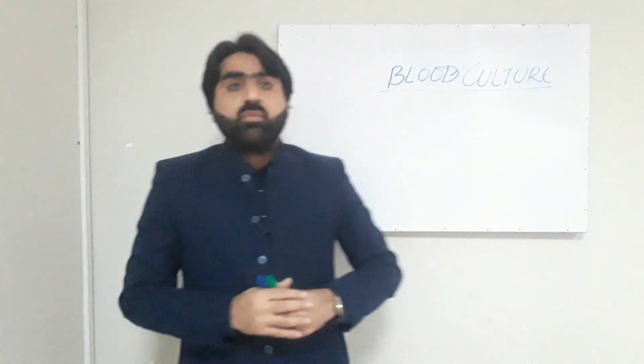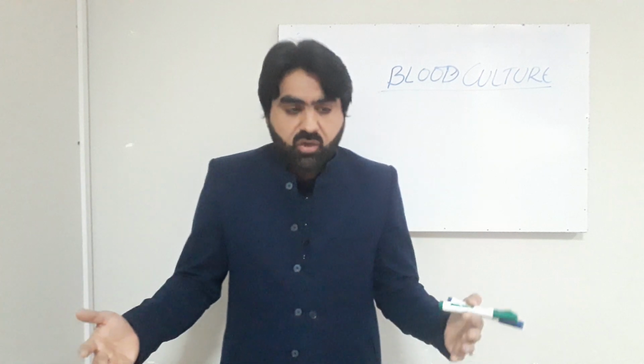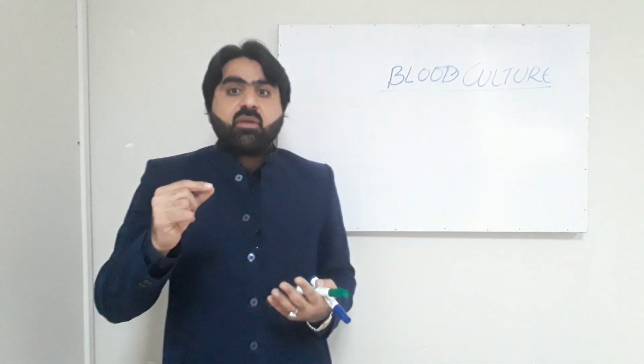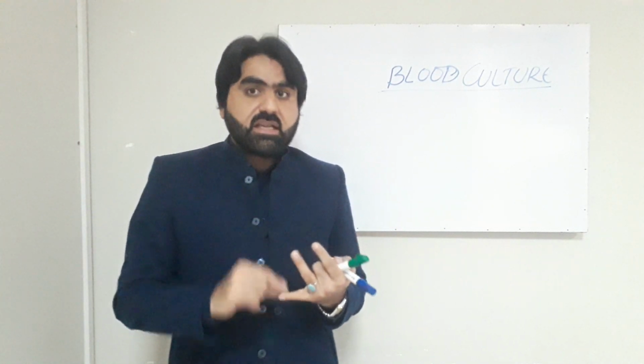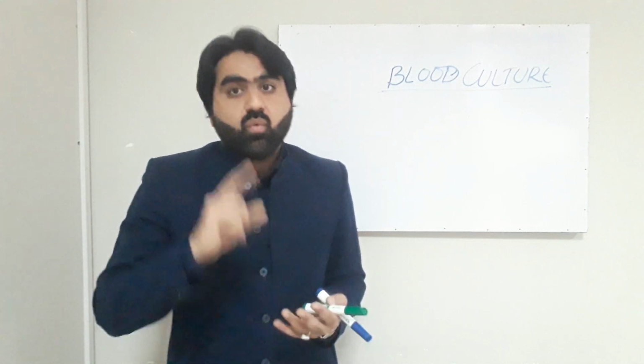Now, which type of medium is recommended? You can use different media provided by different manufacturers, but the minimum requirement is that the medium should contain the basic nutritional ingredients plus special growth factors. Why?